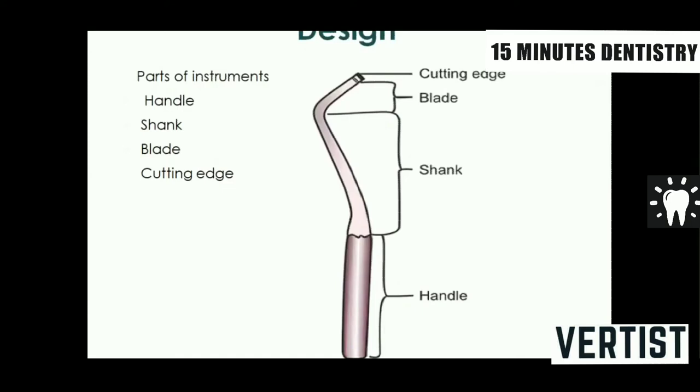Now, if an examiner like me asks you what is the working part of the nib with which you are able to condense the silver amalgam, then the answer would be that the working part of the nib is called the face of the instrument, which is serrated for silver amalgam restorations, because that prevents slippage of the instrument from the restoring surface.